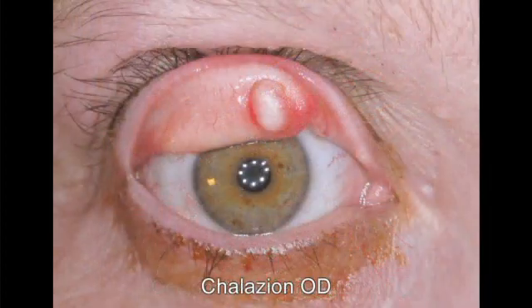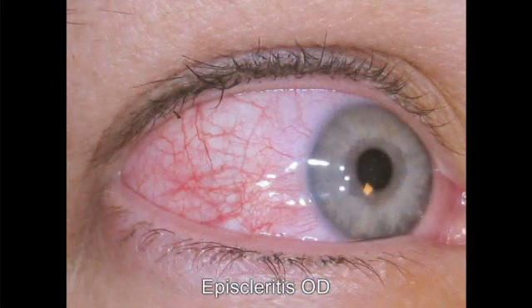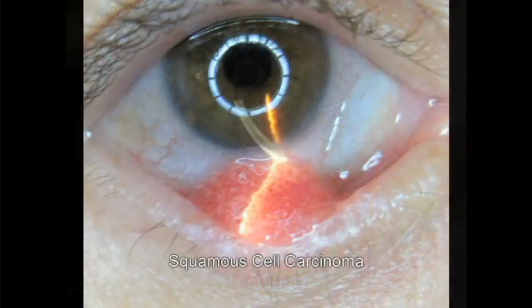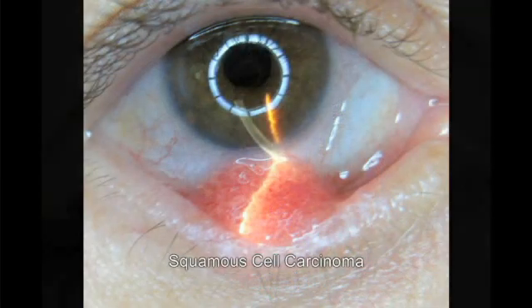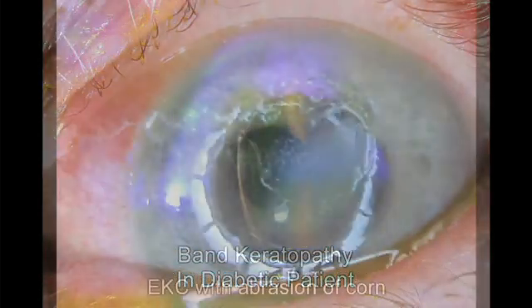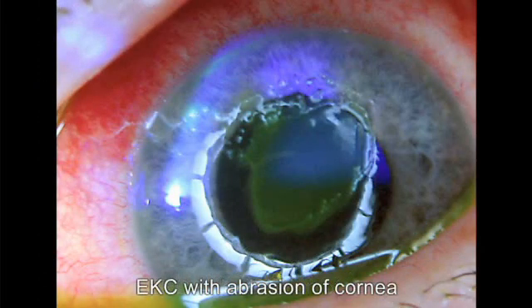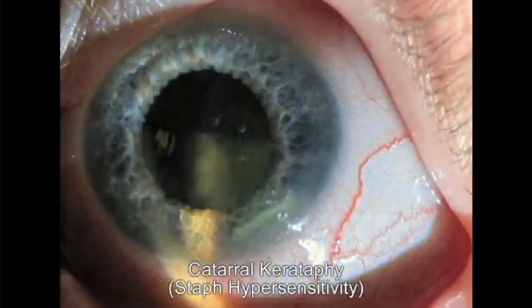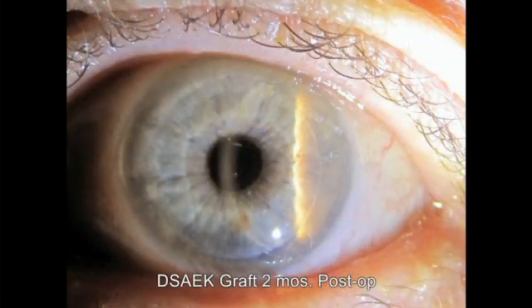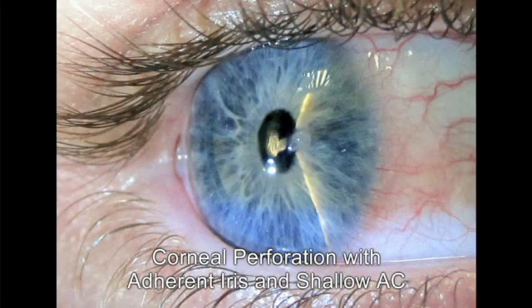I originally developed this system to aid in the orientation of the Toric lens implant, and it is still used for that purpose. But I quickly realized how convenient and useful it was for all forms of ocular photography. Its portability makes it immediately available at any slit lamp without the necessity of moving the patient.